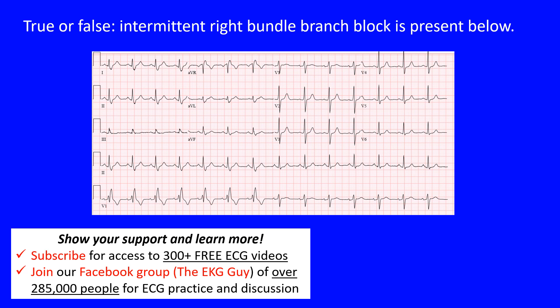Here we have a true or false statement: intermittent right bundle branch block is present. What we have is a 12-lead ECG and you have to know a few things. First, you need to know the right bundle branch block pattern. Intermittent means it shows up but isn't completely present throughout - in some parts of the ECG you see right bundle branch block and in others you don't. So we're looking for a right bundle branch block that doesn't persist from beginning to end.